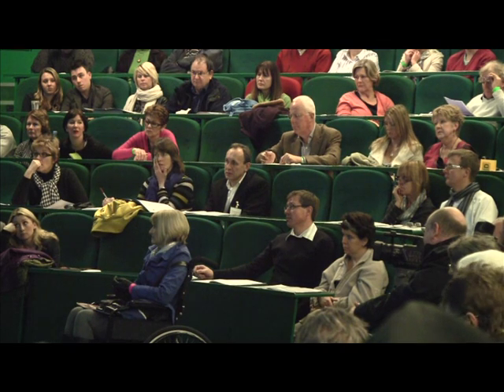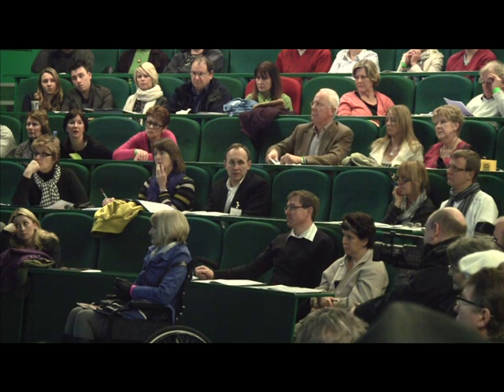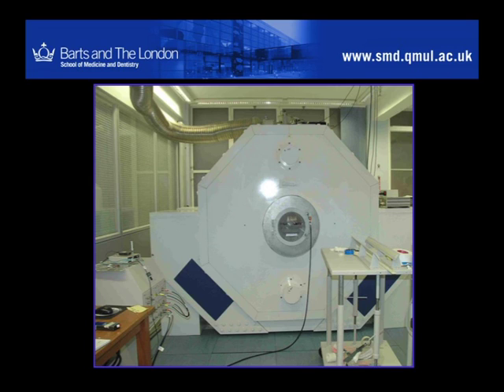In order to visualize this, or to provide a first attempt at visualizing this that can then later be translated into the clinical field, you can use a very powerful machine, more powerful than those that you usually use currently in people with MS. So that's a magnet with 9.4 Tesla compared to 1.5 magnetic field strength in the conventional.